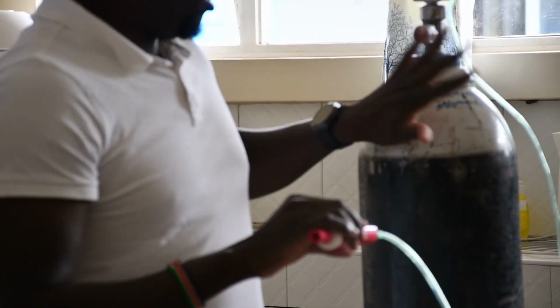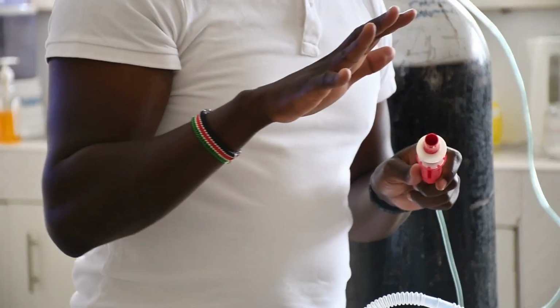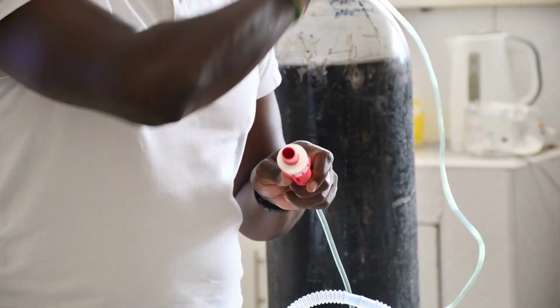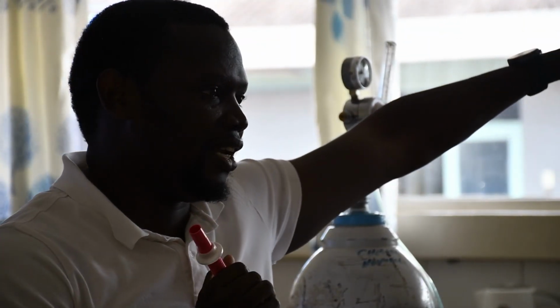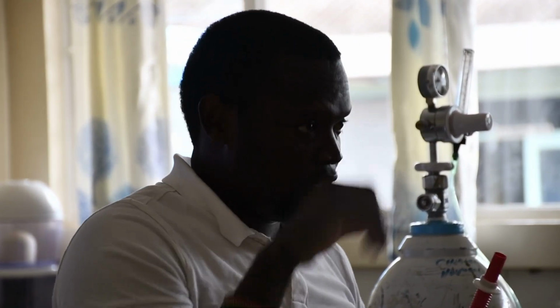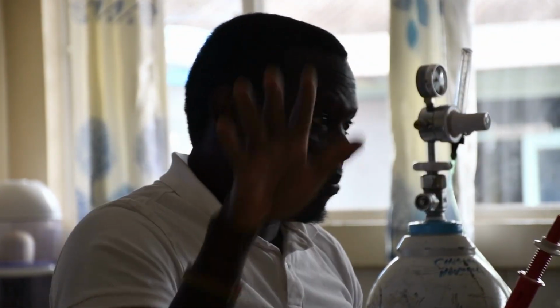What happens is that you have this oxygen source coming in, it's sucking in the ambient air. The ambient air is not clean, especially for the neonate. Whatever we breathe in right now, for the neonate it might be harmful because you see the construction, there might be construction going on, so there's the dust. You can't see them. There are dust particles, there are microbes, viruses, bacteria that might be floating around.